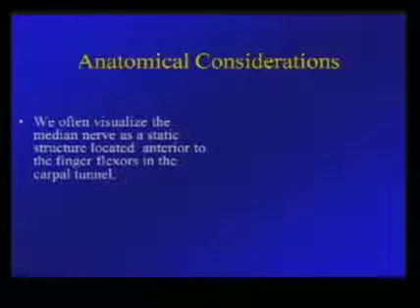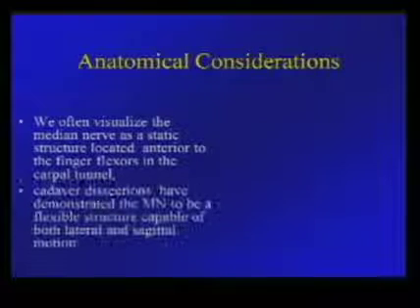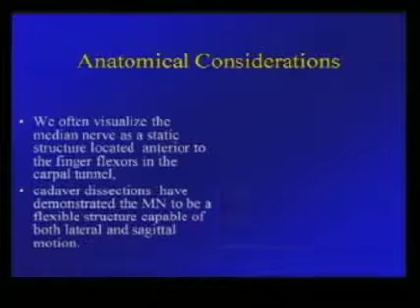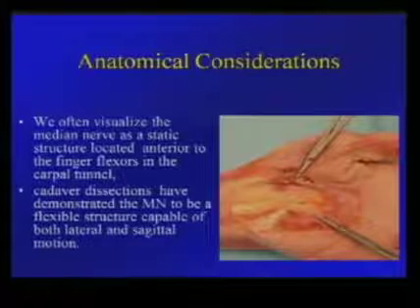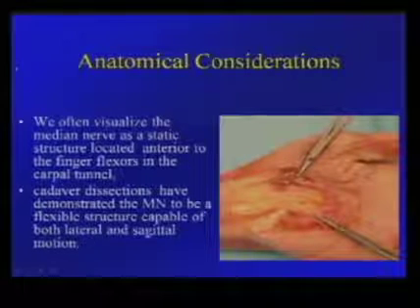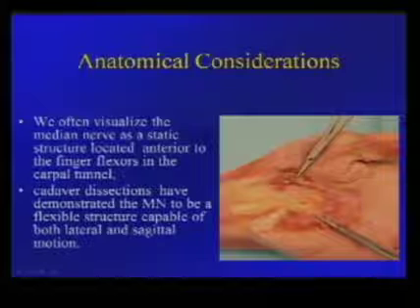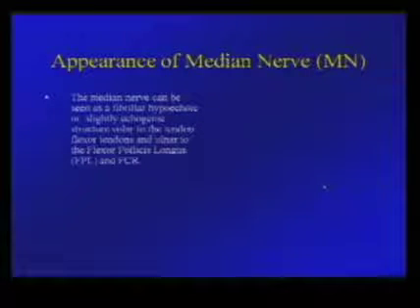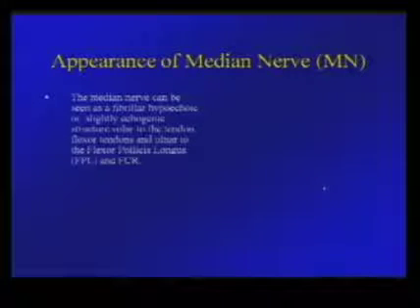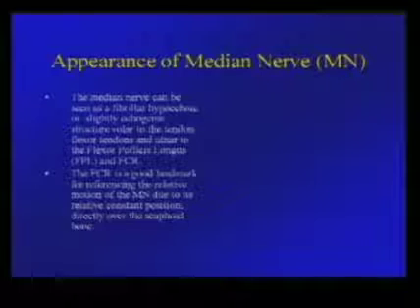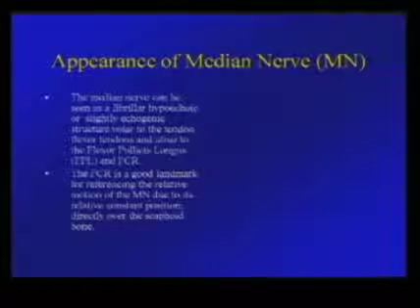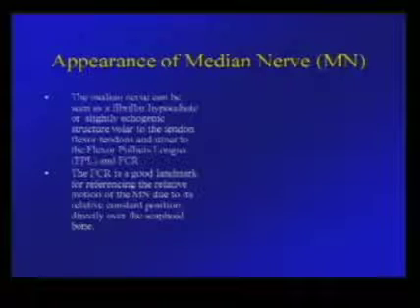We often visualize the median nerve as a static structure anterior to the flexor tendons in the carpal tunnel. However, cadaver dissections we have done have demonstrated that the median nerve is a very flexible structure, capable of both lateral and sagittal motion within the carpal tunnel. The median nerve on ultrasound has a fibrillar, hypoechoic, or slightly echogenic structure, volar to the flexor tendons, at the ulnar aspect of the flexor pollicis longus and the flexor carpi radialis — a good ultrasound landmark due to its relatively constant position relative to the scaphoid bone.